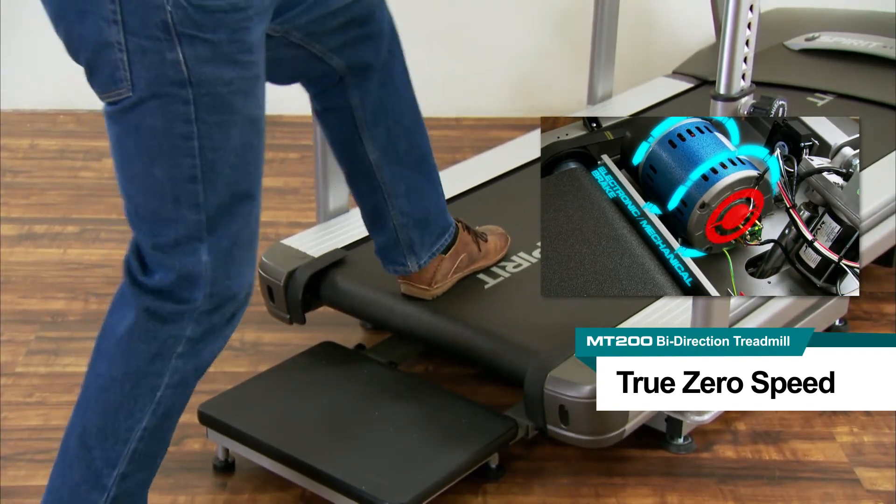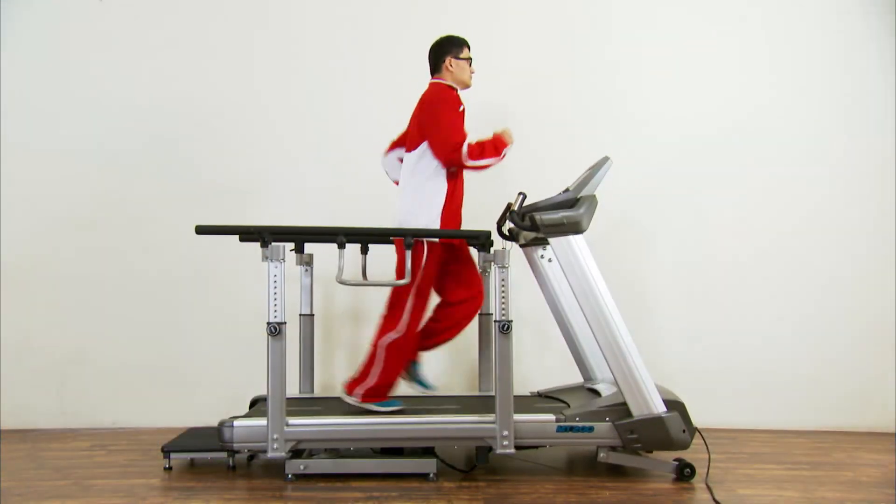The true zero speed is electronically controlled by a mechanical brake.